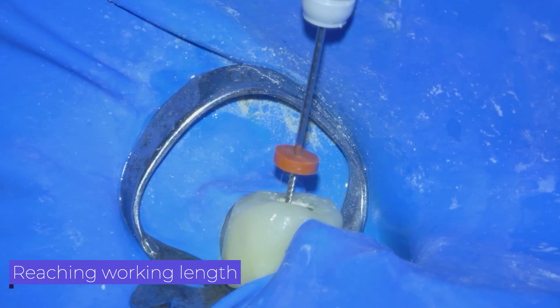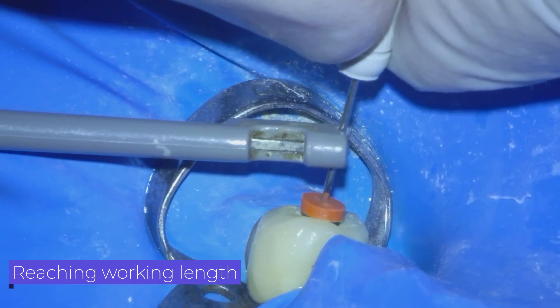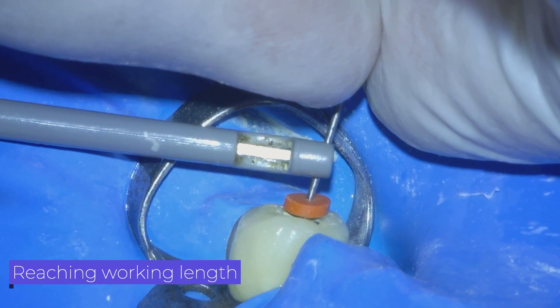The difficulty in measuring working length in crown cases lies in the ineffectiveness of electronic apex locators once the file comes into contact with the metal. Here we get the apex locator to work well by not allowing the file to contact the metal of the crown.